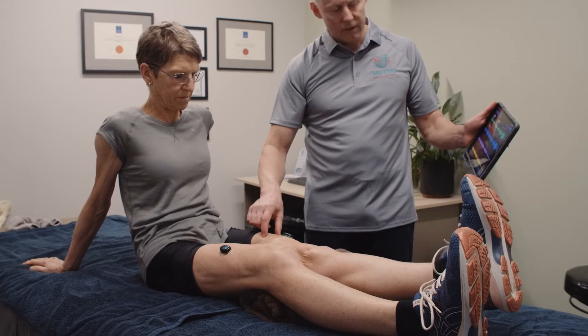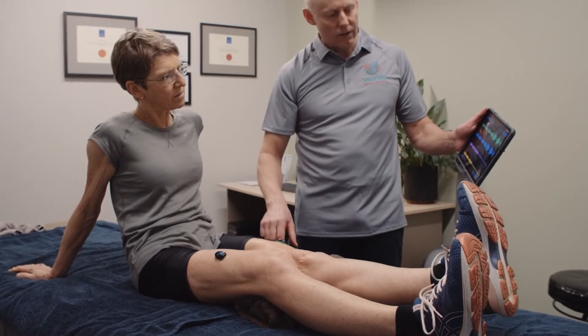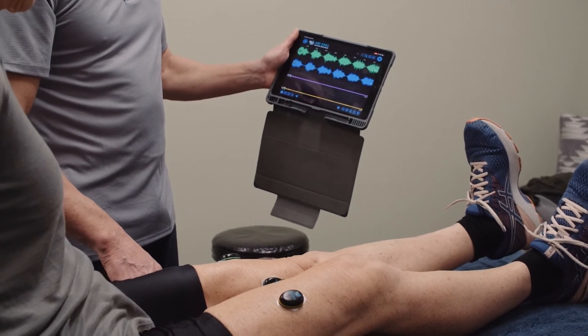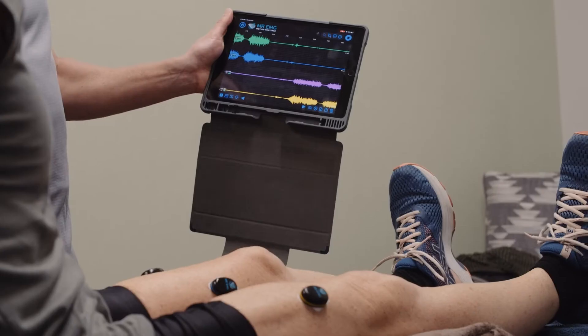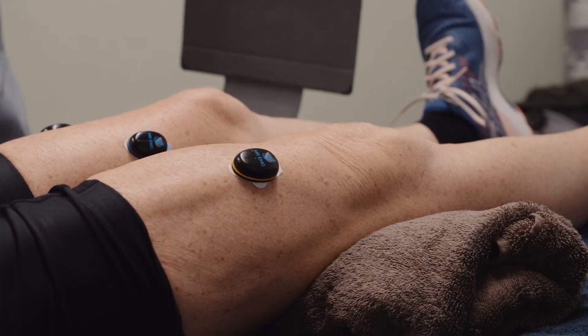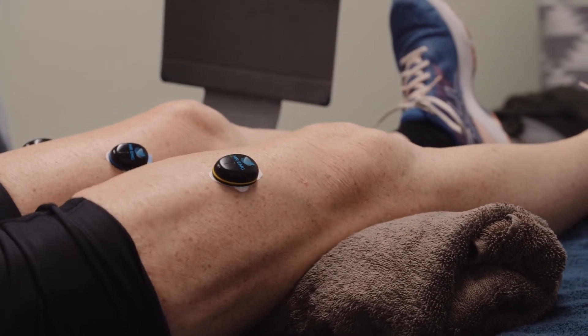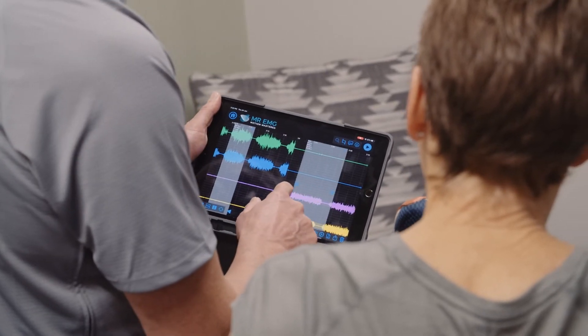Now we will observe muscle outputs performing a single leg extension with a towel under the knee. As surface EMG is a measure of effort, allow your subject to view the biofeedback during this activity to ensure they are trying with a consistent attempt each time. Once again, you are looking for any visible differences between muscle groups left to right. Before moving on, compare the results of the quadriceps muscle outputs between legs with your subject.